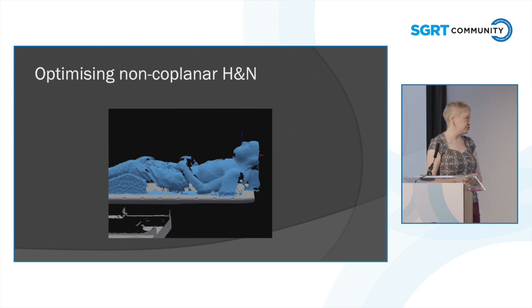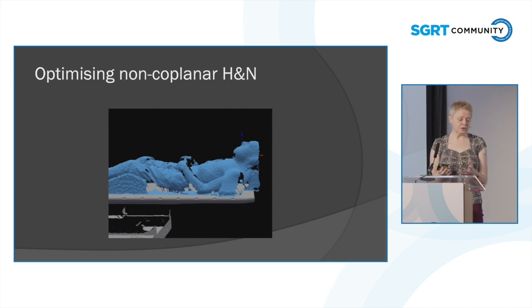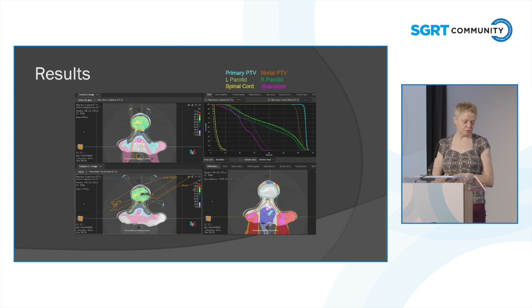And this was the surface captured on him. So you can see how much he is propped up. He couldn't get his elbows and his arms in any other position. So we had problems getting an isocenter that would work for full arcs anyway. We were either going to hit his chin, his head, or we were going to collide with the bed. So moving to couch kicks actually helped us optimize the isocenter as well.